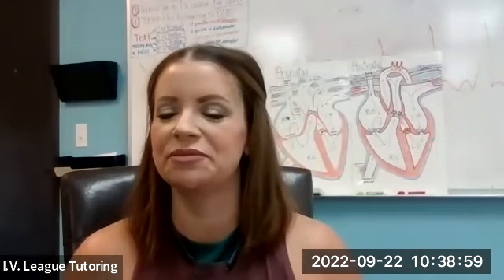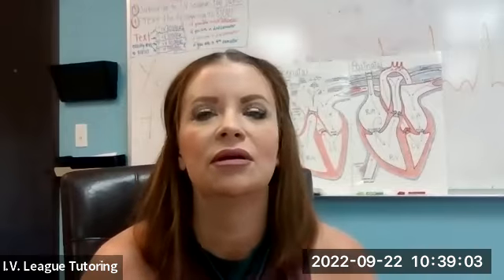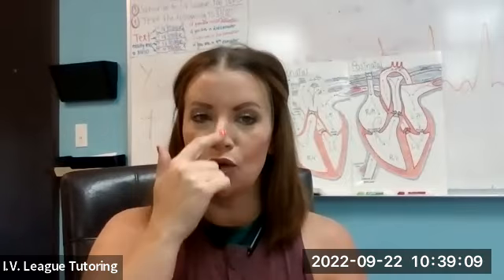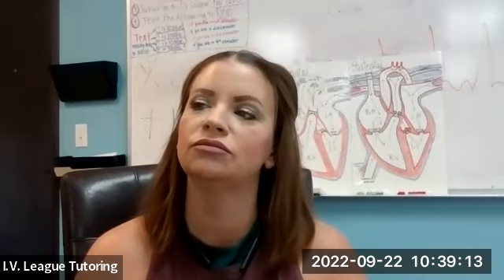Let's talk about some sinus rhythms. What does a sinus rhythm mean? Start with the SA node. It originates in the SA node, where God intended it. So in order to say that something is a normal sinus rhythm, what has to be true?